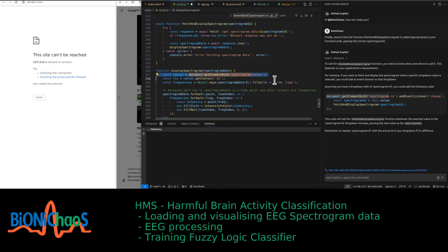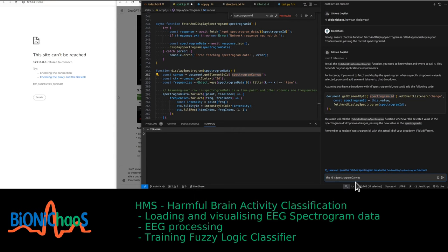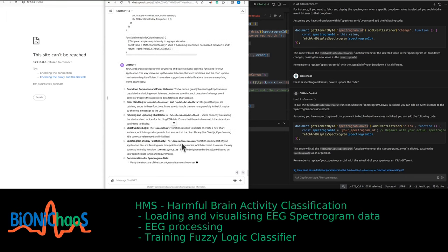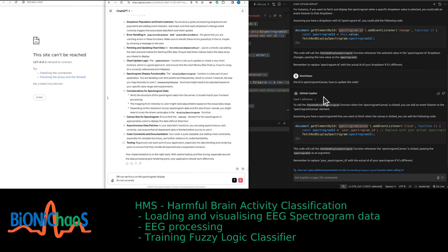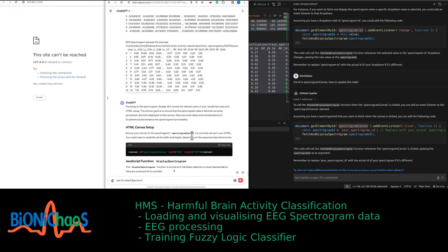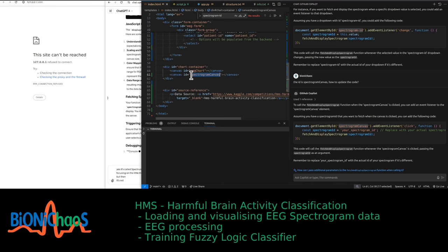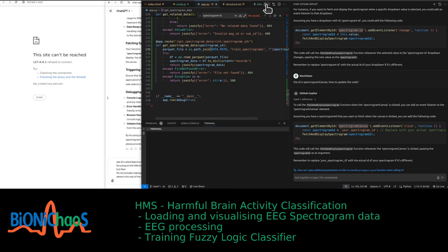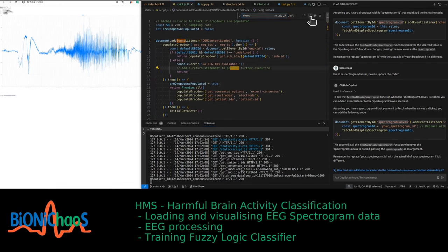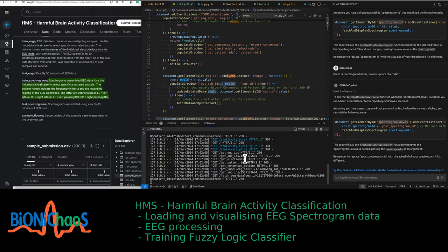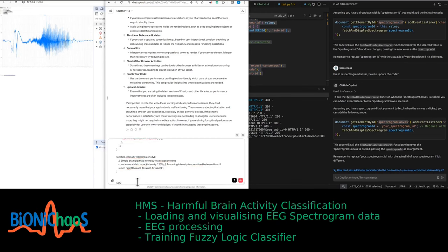It's called 'spectrogram_canvas' — it doesn't have a spectrogram ID and doesn't know that. That is a spectrogram canvas for spectrogram display. It's focusing on the little things but not actually helping. There are seven change events — the EEG chart keeps expanding when clicking somewhere on the screen, which we don't want. The spectrogram is not visible at all.